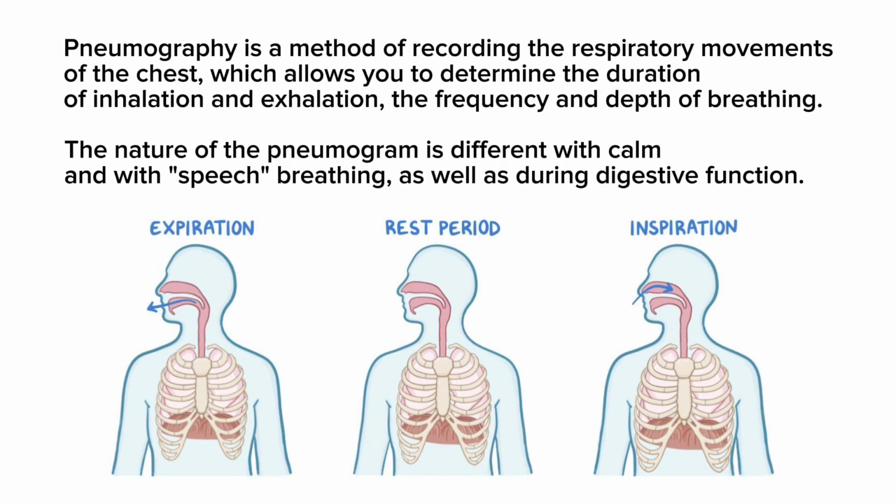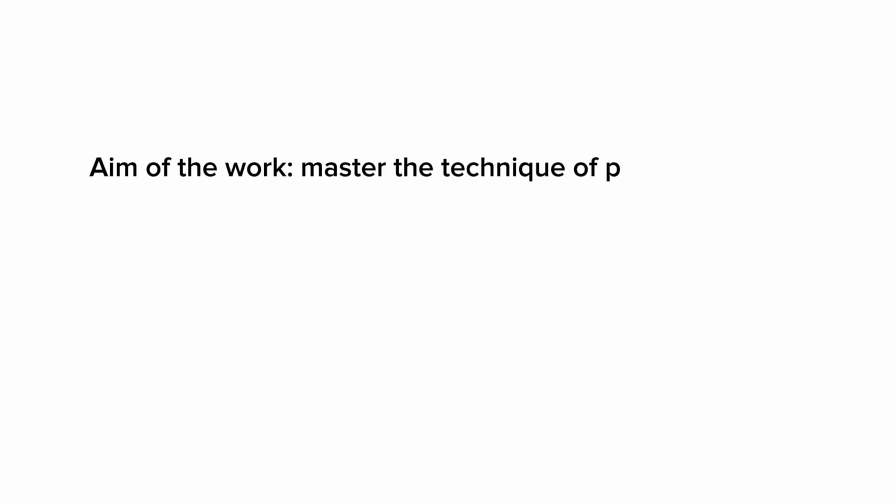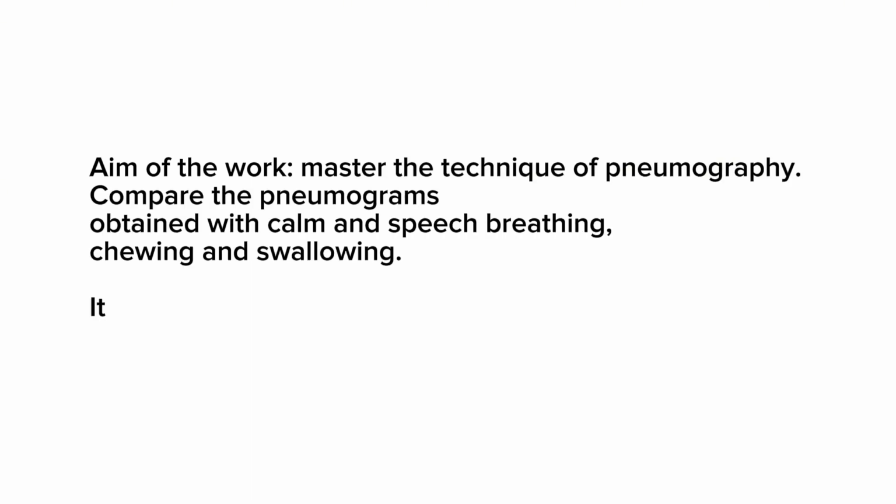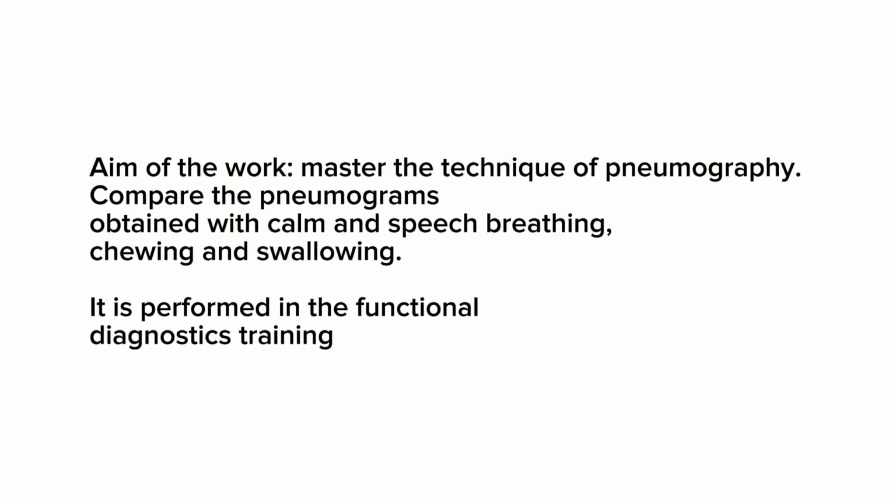Pneumography is a method of recording the respiratory movements of the chest, which allows you to determine the duration of inhalation and exhalation, the frequency and depth of breathing. The nature of a pneumogram is different with calm and with speech breathing, as well as during digestive function. Aim of the work: master the technique of pneumography. Compare the pneumogram obtained with calm and speech breathing, chewing and swallowing. It is performed in the functional diagnostic training room.